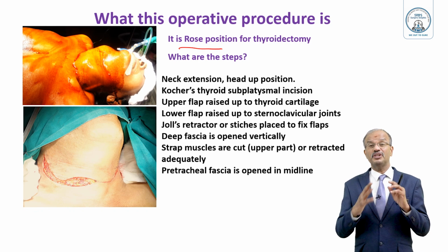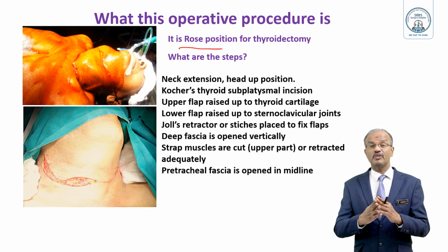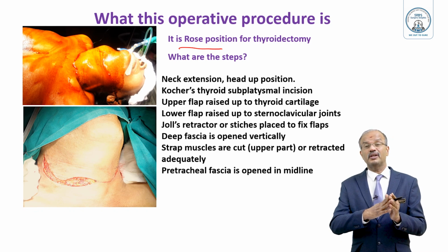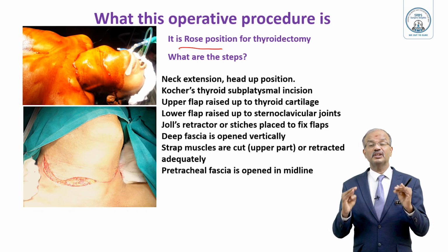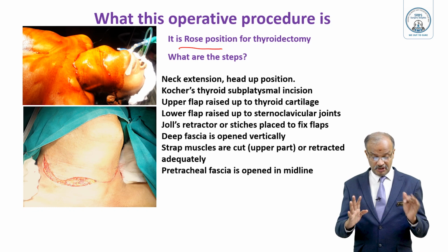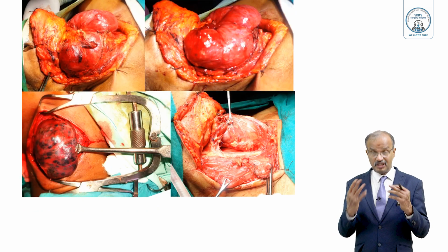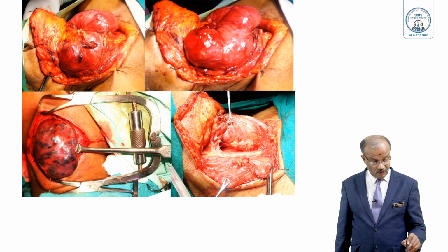the complications, position, methods, how exactly: middle thyroid vein first, next superior thyroid pedicle, then inferior thyroid pedicle, recurrent laryngeal nerve or parathyroid. So the two important structures we have to retain to avoid injury or deficiency of these structures. This is the point you have to remember. Raising the flap also, all those things are important. So these are the steps. You can see that raise the flap, very large thyroid here, upper flap, lower flap here, sutures.